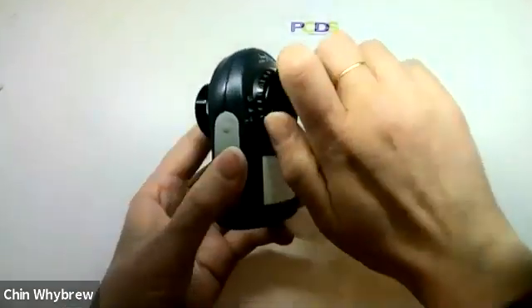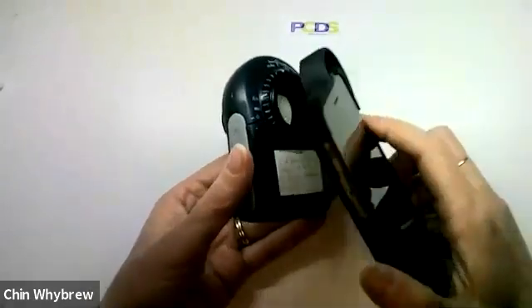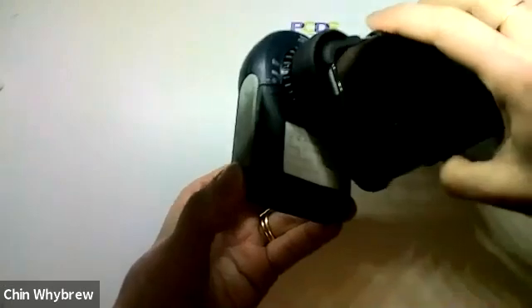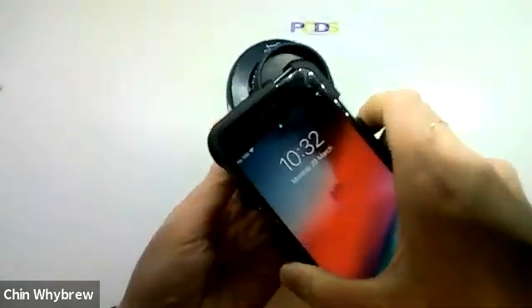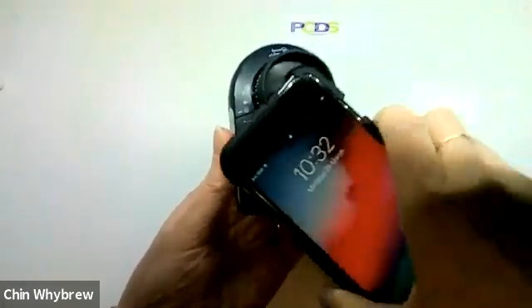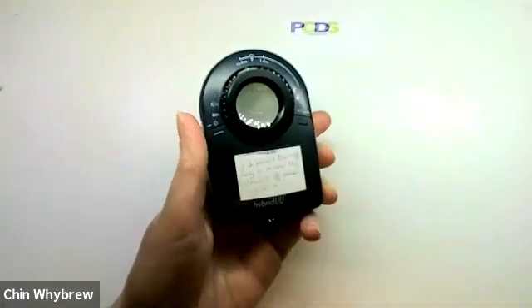And once you've got that ring attached, you can use it also with the standard Dermalite adapter. And you will notice that although it will slightly unscrew the magnetic bit, it will not adjust the focus as you move the phone for taking the picture.